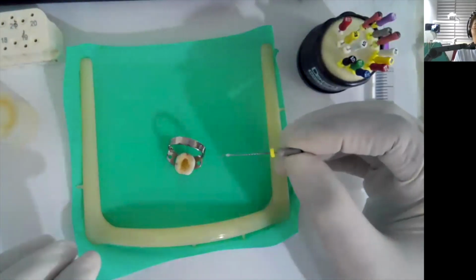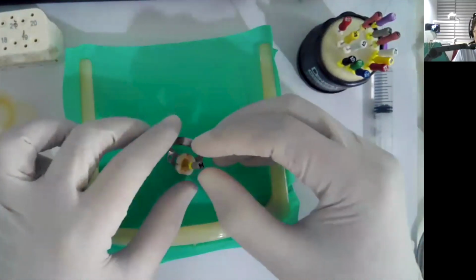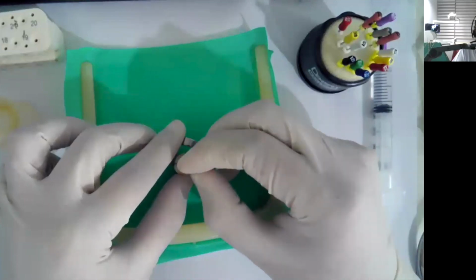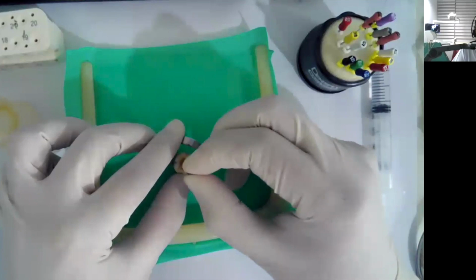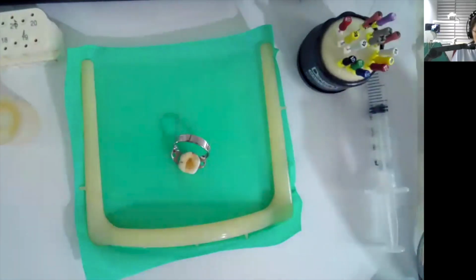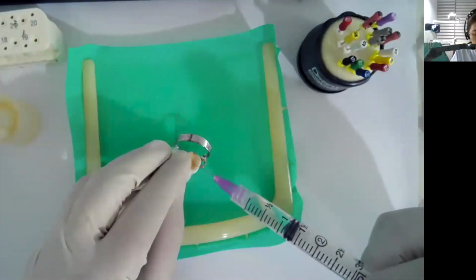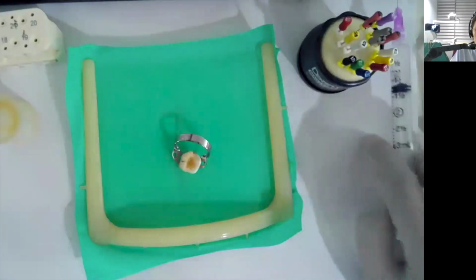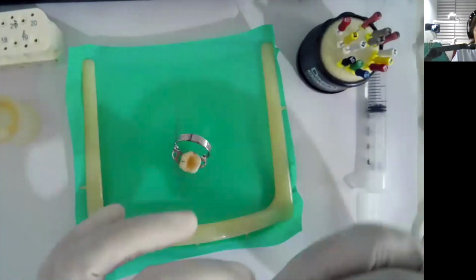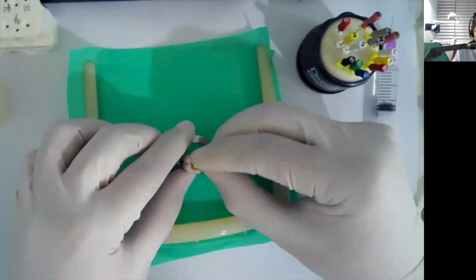So I'll be starting on the mesiobuccal. Okay, work on this file up to the reference point. So I just have to do watch winding technique and up. Okay. When it's loose, I can do some filing motion. I will irrigate again slowly. And then I'm now going to change my file to size 10, and I'll put some of the EDTA. So it's not that difficult anymore.